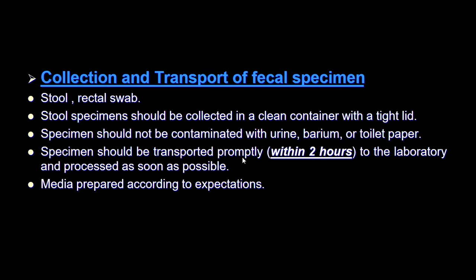The rule of thumb is that the specimen should be transported to the lab as soon as possible, within 2 hours. Very, very important to get that, the sooner the better.